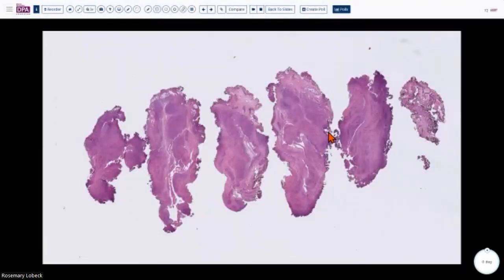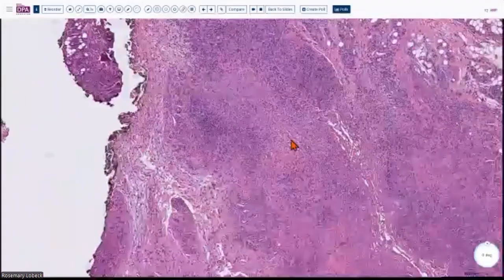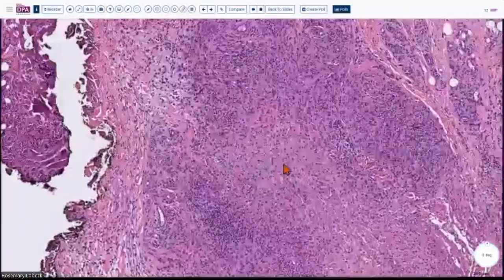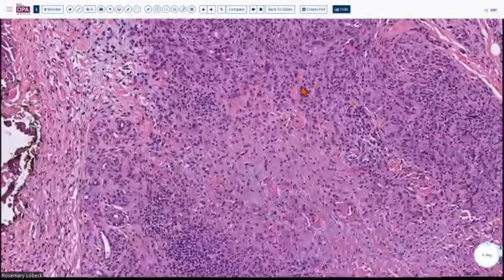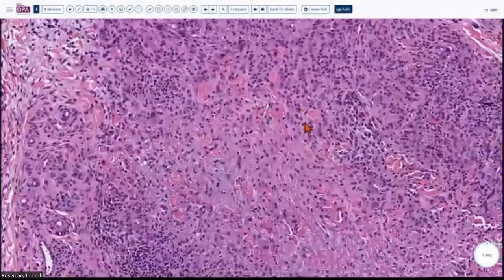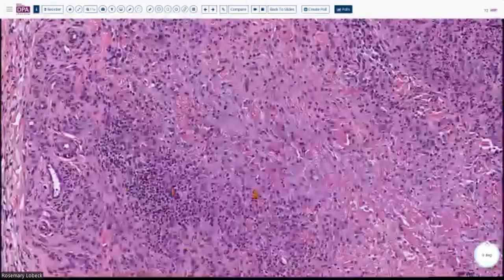So I want to compare this with a case of a rheumatoid nodule, right? So rheumatoid nodule is the closest lesion where you get a granuloma with necrobiosis in the center. So we can just zoom in anywhere here. You can see that there is a similar type of necrobiosis going on in the center, and it's surrounded by a vague palisading of these plump cells, which are basically histiocytes. In this case, it may be slightly difficult to identify this as not an epithelioid sarcoma because you do have this chronic inflammatory infiltrate in the background, as you might see in a rheumatoid nodule.